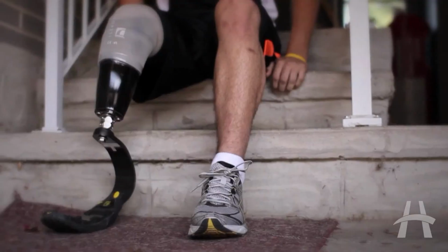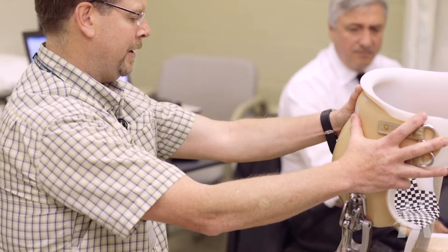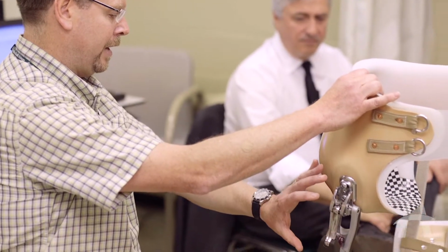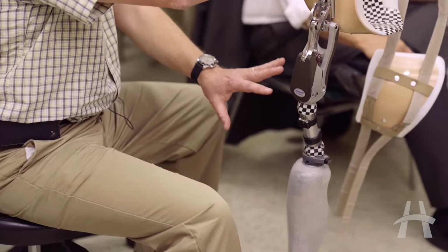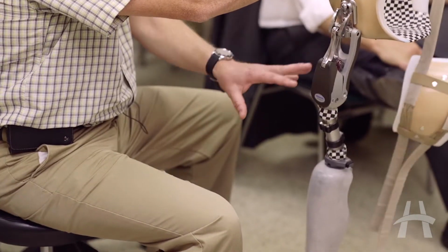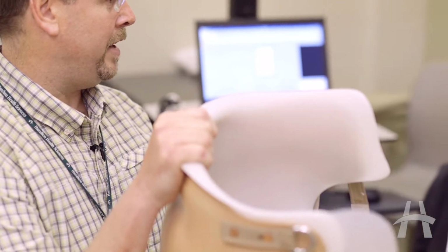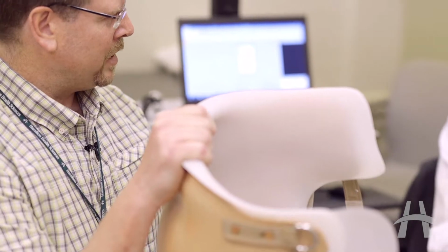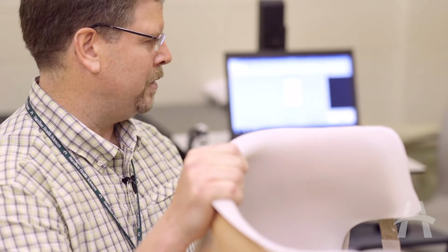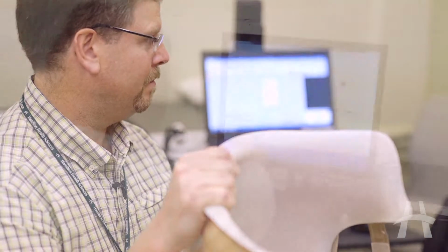So the prosthesis is comprised of the part that fits onto the body, which is the top portion or the socket, and there's a hip and a knee component. This represents probably the most advanced technology available today. If it fits as perfectly as we can make it fit, that should mean it's comfortable. Because it's fitting so closely, if there's anywhere that's a little too close on a bony prominence or something like that, that has to be modified quickly.